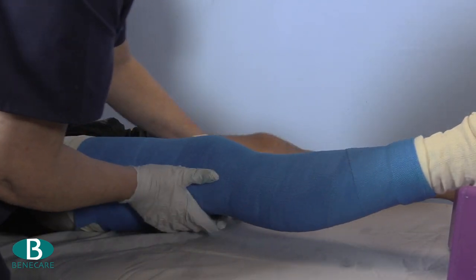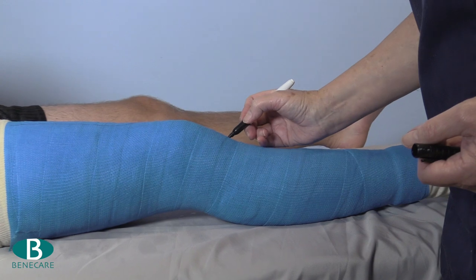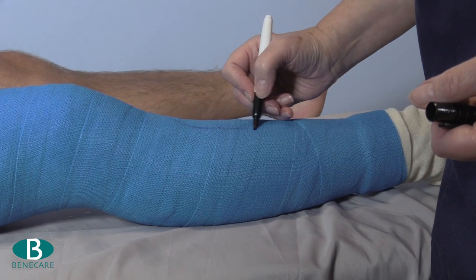Mould the cast to the contours of the limb, paying particular attention to the quadriceps. Once it has reached the initial set, rest the cast on a soft pillow and mark the cast for removal.